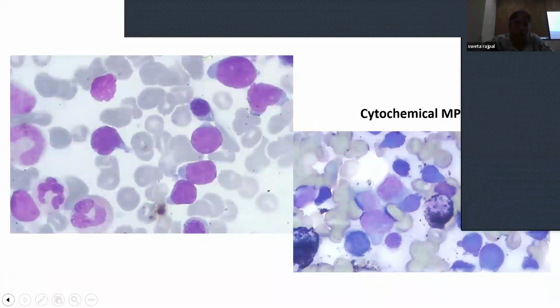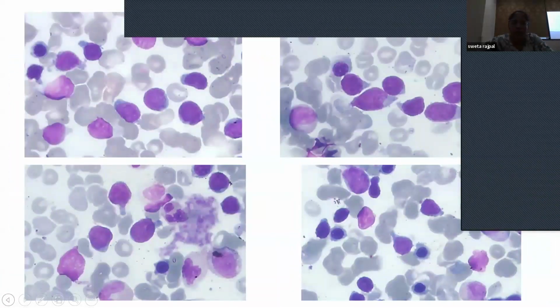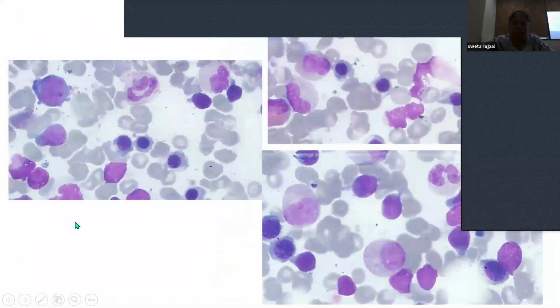Okay. So someone asked us to tell about normal color. So about the erythroid color that I was telling of normal maturation, it is like this only. These are different maturation stages of normal erythroid precursors. This one is early, and these are intermediate where they are having polychromatic cytoplasm. And this is early, that is having basophilic or blue cytoplasm. So early erythroid are rich in RNA, so they will have blue cytoplasm, and as it matures, it will gain color, the hemoglobinization will happen, and it will gain a mix of blue and pink color.